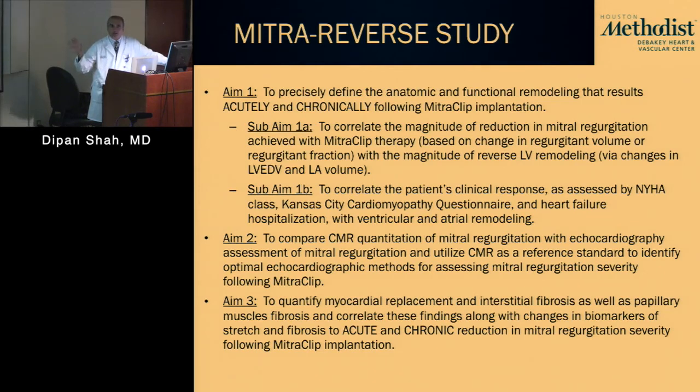And this is just kind of an overview flavor of some of the things that we're looking at from the standpoint of fibrosis, both looking at replacement fibrosis via the late gadolinium enhancement technique, which again has been around now for about 15 years, as well as this newer technique of looking at extracellular volume fraction. And this technique really has only been around for the last probably 4 or 5 years. Okay? Any comments or questions?